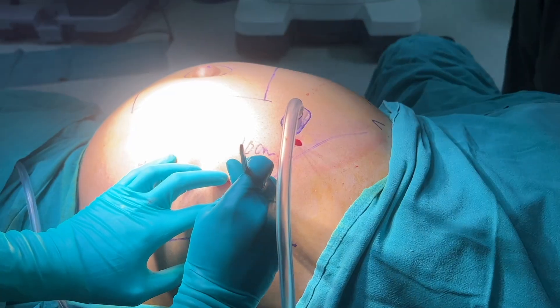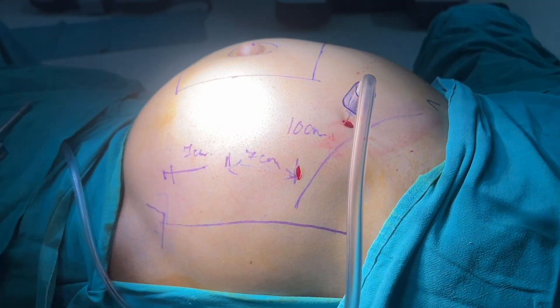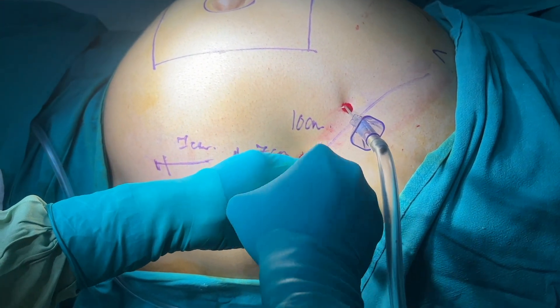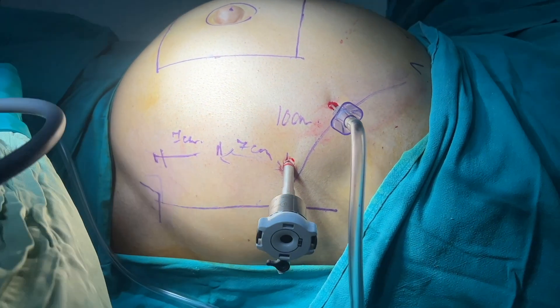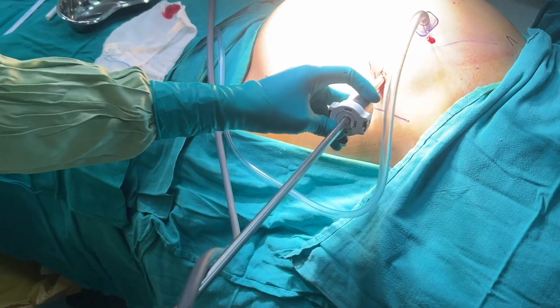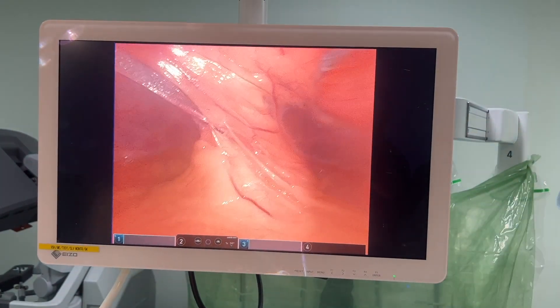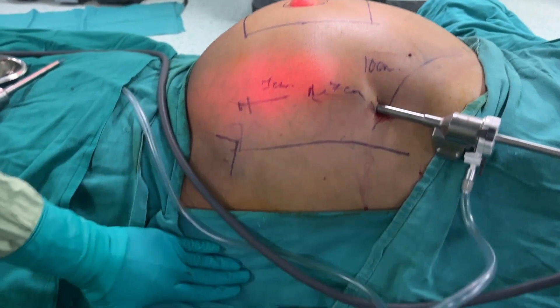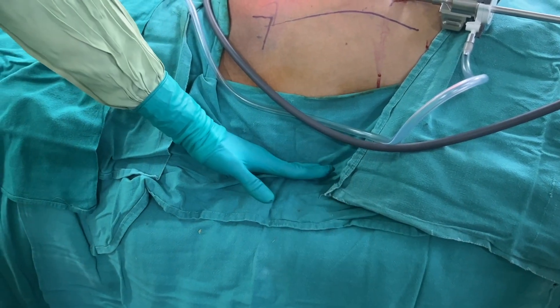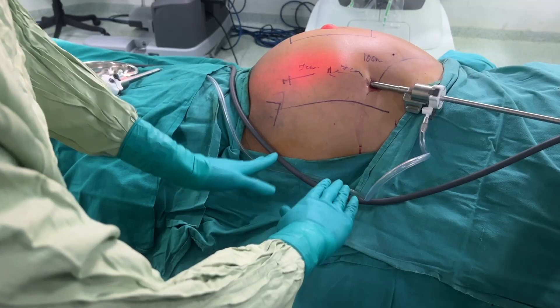One can also use an optical entry for placement of the first port, which can later be upgraded. We need to be extremely cautious while putting the first robotic trocar, and once placed inside the abdomen we quickly do a diagnostic laparoscopy to confirm no injury to visceral structures. The patient's hand is hanging by the side with underarm support to ensure no interference between the robotic arms and the patient's hand or the table.